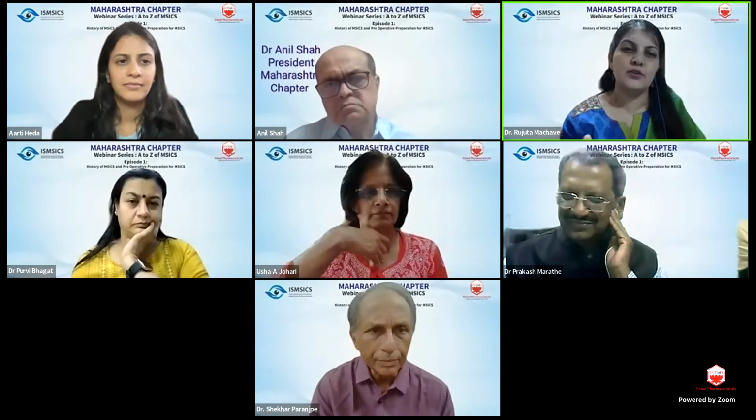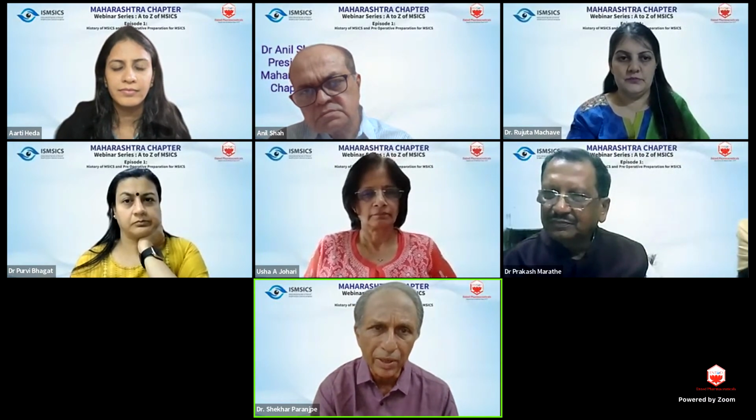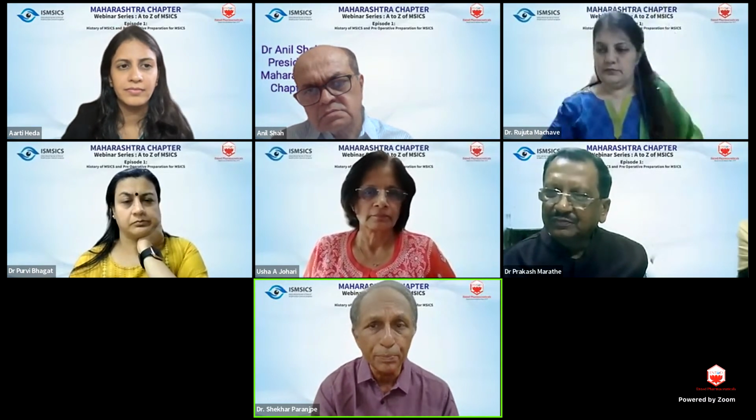Usually I also do the whole drill 1 week prior to the surgery, whether the patient is comfortable sleeping there for at least 20 minutes and whether I'm comfortable, and then only I take them for the surgery. Yes, we have to decrease the height of the table. In such a situation, don't insist on doing topical anesthesia. You may jolly well consider giving peribulbar or some other block, infiltrative anesthesia. That way the patient is comfortable and then you can perform the surgery a little quicker.